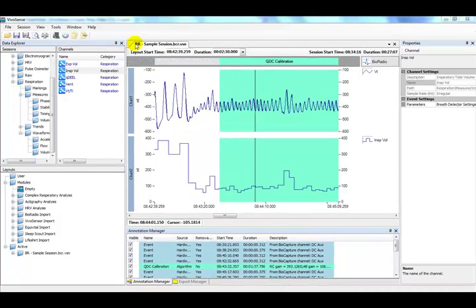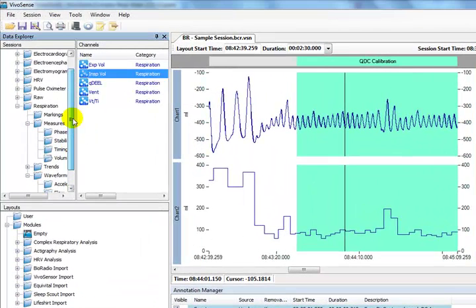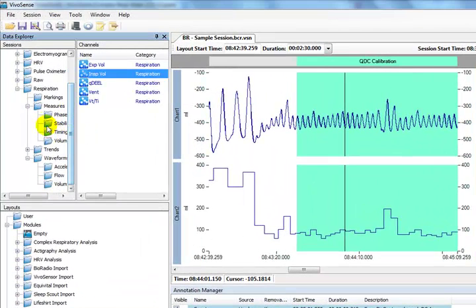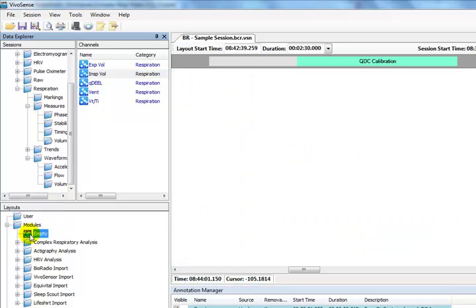The respiration data channels can be found under the Respiration menu in the Data Explorer. The respiration channels are divided up into waveforms, markings, measures, and trends as with all VivoSense data channels. Some of these data measures will only be available when dual band plethysmography data has been collected. Let's empty the synchronized chart panel and view some of this data.